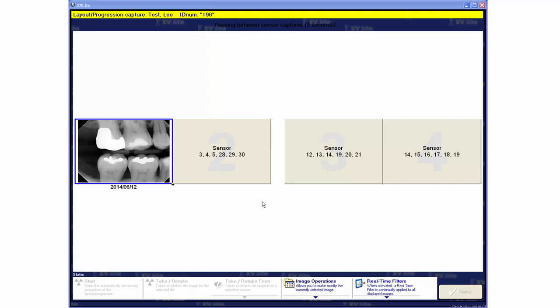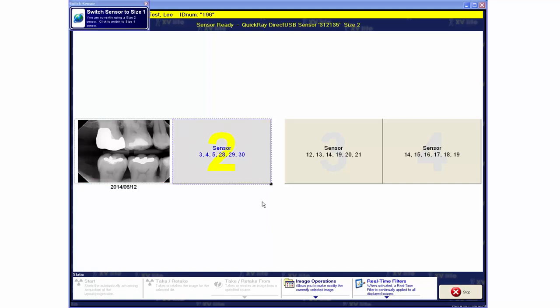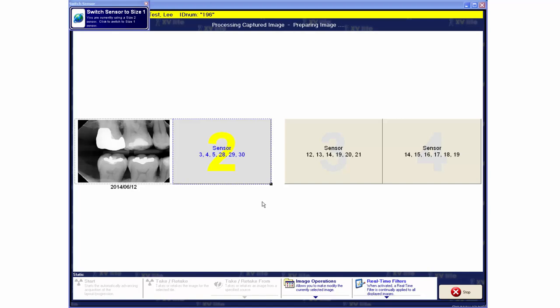The operator then repositions the sensor and captures the next image in the ByteWing series, which is then displayed by X-VLite.